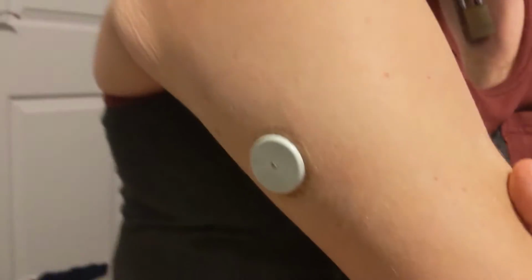Anyway, I'm here today to talk about this old thing on my arm because I get a lot of questions about it because it shows up in my pictures and stuff. So for those of you who are not familiar with it, it is called a Libre sensor. It is predominantly for type 2 diabetics for measuring your blood sugars. So it's a neat little thing. For those of you who are diabetic and hate finger pricks, this is the thing for you.